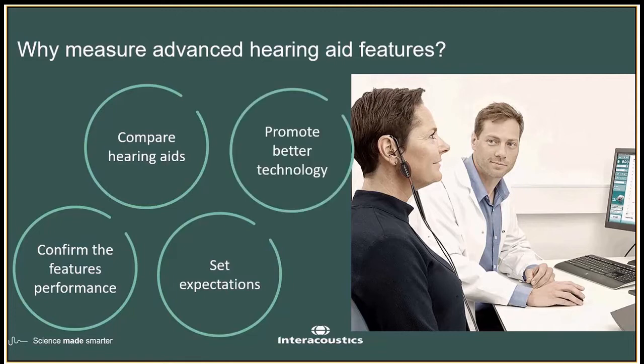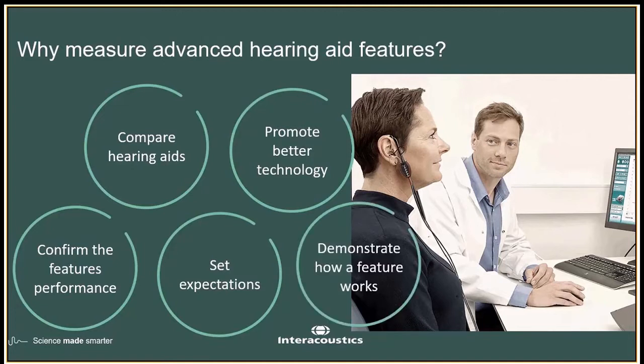We can also promote better technology through showing how these features are working. So if we can show more modern or newer forms of this technology, we can encourage use of that over older forms or not using those technology forms at all. So it's a nice way to demonstrate so that then we can actually apply it a bit better. And that leads me quite nicely into the final point that I make here. So we can use it to demonstrate how a feature works. This also helps people to understand the limitations and how to get the best out of their hearing aid in different scenarios. So let's say if they're at a restaurant, where to sit, where to position themselves, and how to work with their device when talking to people.